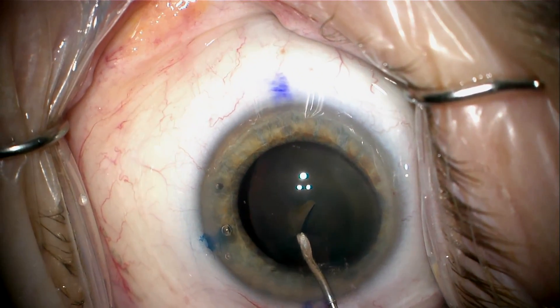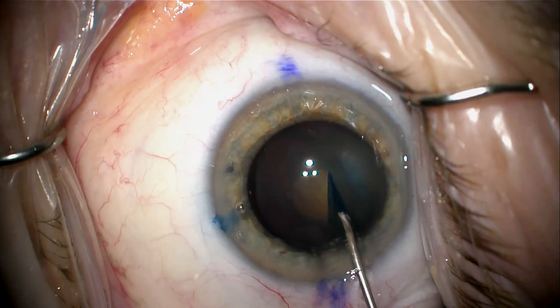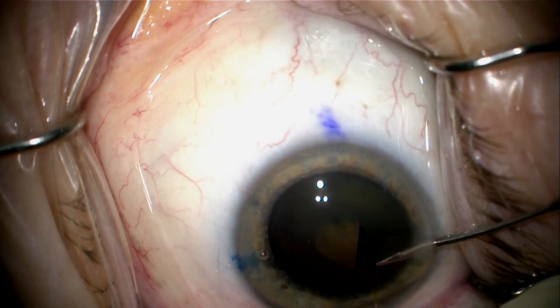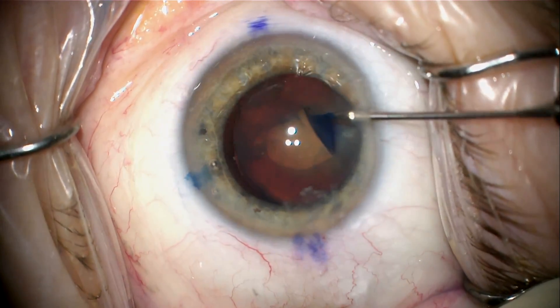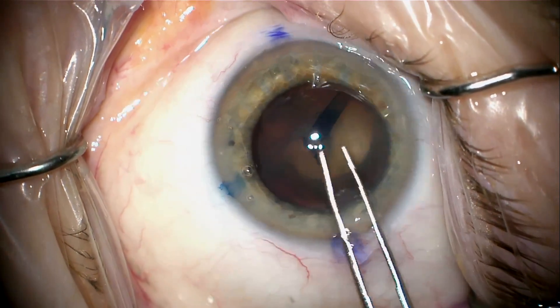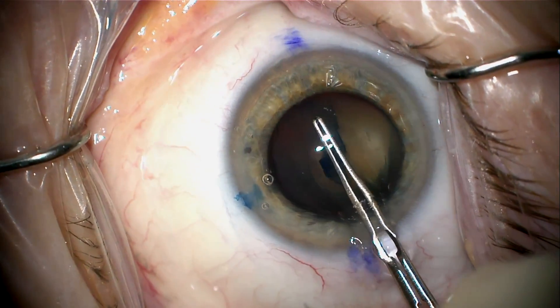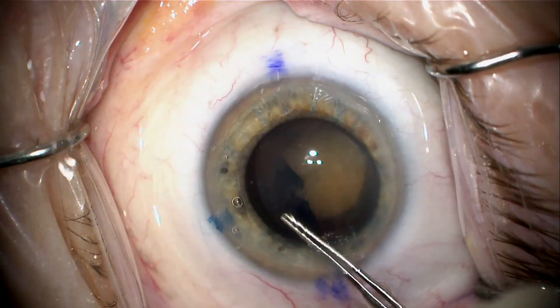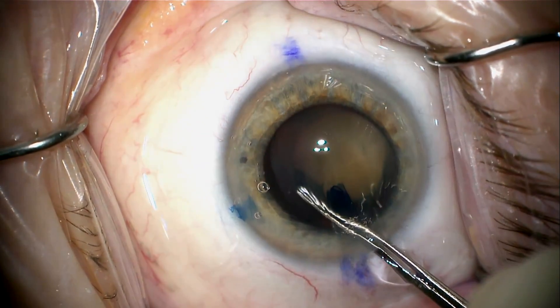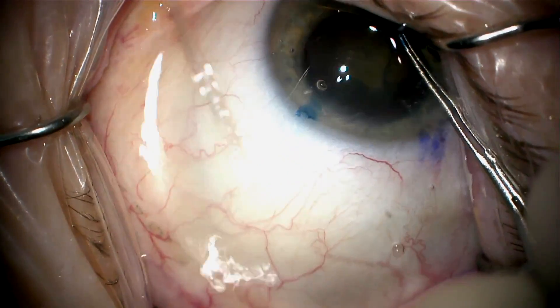The lens is loose, as you can see here. I'm going to try to center the capsulorhexis on the center of the lens rather than the center of the pupil, as the lens is a bit dislocated and pulled to the right side of the surgeon's view. So here I'm tearing the capsulorhexis very carefully. I want to make the rhexis opening large enough to phaco this very dense cataract efficiently without being hemmed in. But as I get to this area, the lens is tilted back a little bit, and you have to be very careful — without countertraction from zonules — so that the rhexis doesn't run out.